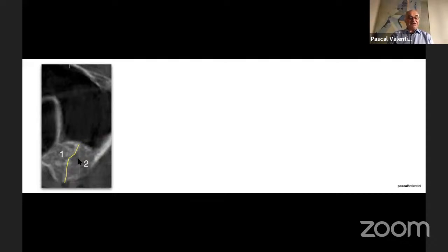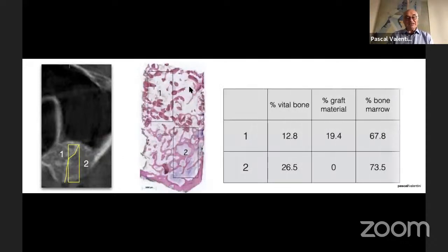a biopsy here, and looking at the biopsy, you can see two different areas exactly as in the previous case, with no more biomaterial remnants within the regenerated area. So even if we have an infection within the sinus, it is not necessary to regraft. We have to be patient and wait for the natural healing of the previously destroyed area.